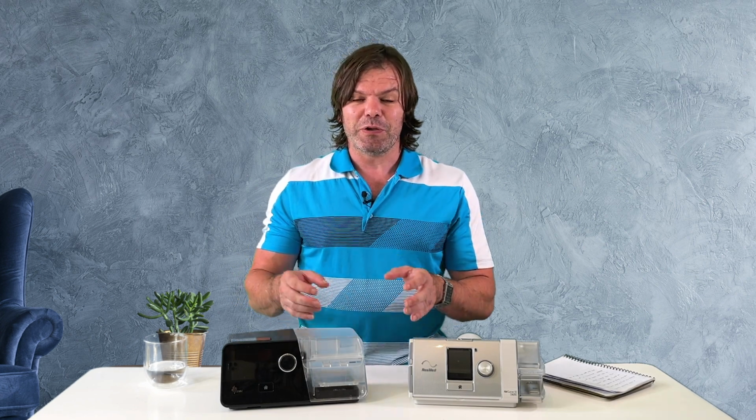The therapy in general, in terms of positive airway pressure, hasn't really changed a whole lot in 35 years. If you break it all down and take away the shell and all the marketing terms and all the bells and whistles, the machine itself is basically just an air pump. It brings air in through the back, adds a little bit of moisture to it, and then pushes it down the tubing into your mask, and that obviously forces air into your lungs. So you're really just looking at a very expensive air pump.